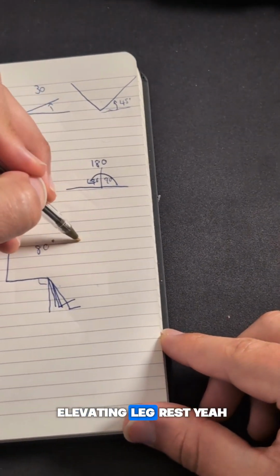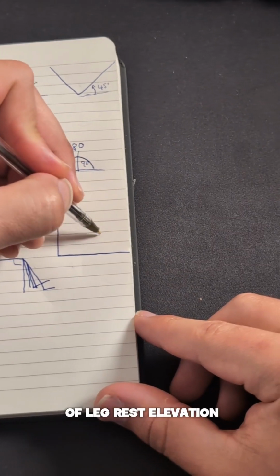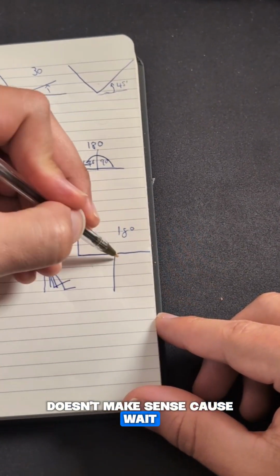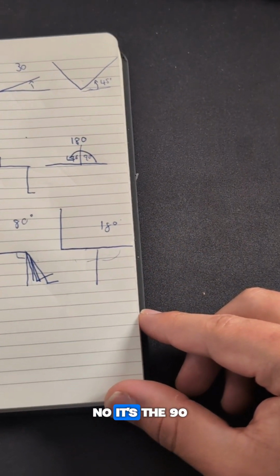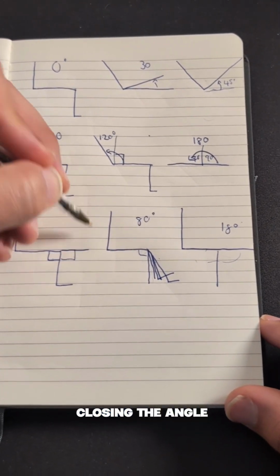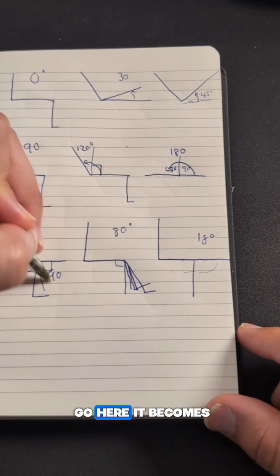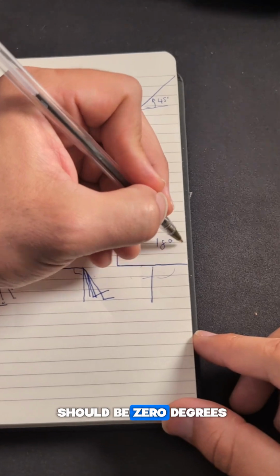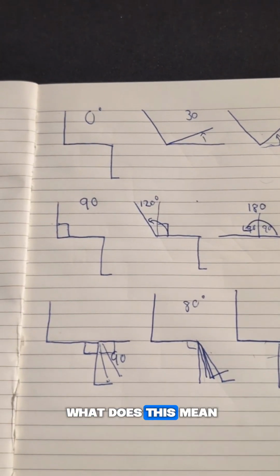If we're talking about elevating leg rest, all of a sudden we change the rules and we're like, oh yeah, this is 180 degrees of leg rest elevation. But then it just doesn't make sense, because wait, is it 90 plus 90, 180? So that makes sense? No, the 90 is coming from here, and we're closing the angle, so it's getting shorter. So from there is 90 degrees, but then as we go here, it becomes 80, 70. So really this should be 0 degrees, but it's not. It's all so confusing.